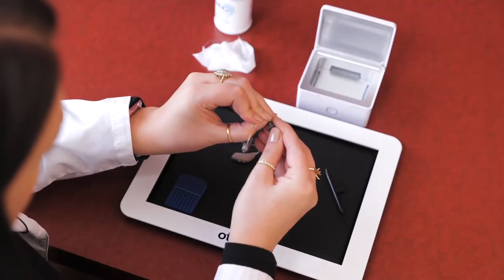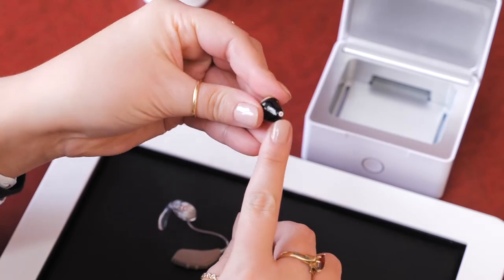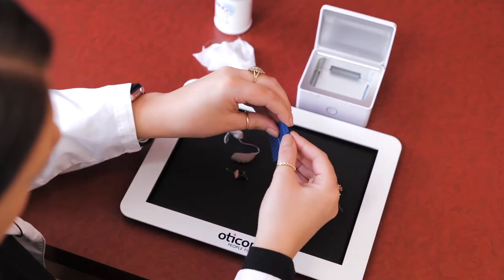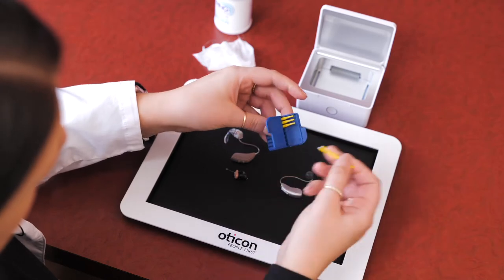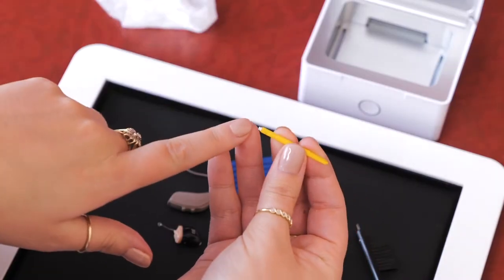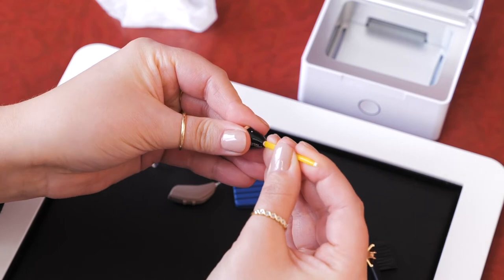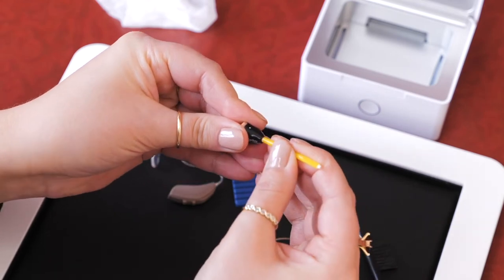Some hearing aids have wax guards that can be changed. Wax guards help protect the receiver from wax that can cause damage. There are various wax guard systems for changing them, but they're all pretty similar. This particular hearing aid uses these sticks. When you take out one of these sticks, you'll notice a small white piece on the end and that the other end is empty. Take the empty end of the stick, put it into the tip of the hearing aid — this will take out the old wax guard. Turn the stick around and insert the new wax guard.